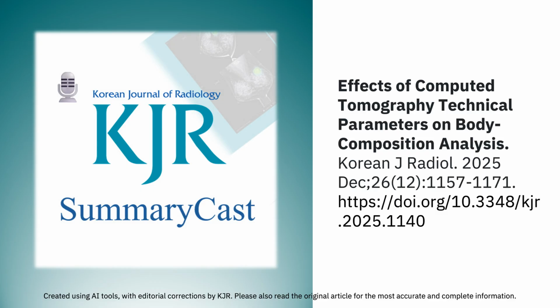Let's talk about what happens after the scan is acquired, reconstruction algorithms. Right. The classic method is filtered back projection, or FBP. But the modern standard is iterative reconstruction, or IR, which is much better at handling noise, especially in low-dose scans. But IR has a reputation for creating a smoother, sometimes described as plasticky, image texture that seems like it would directly affect attenuation measurements. It does. A phantom study found that SMA was consistent between FBP and IR, but the muscle density, the SMD, showed a small but consistent decrease with IR.